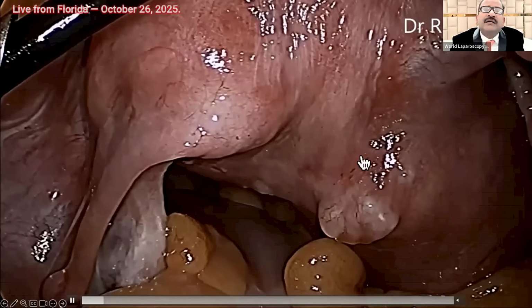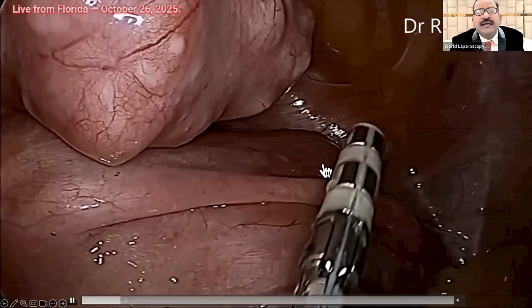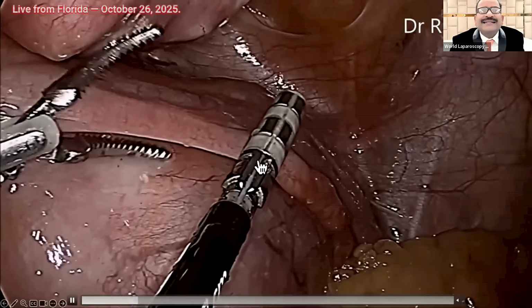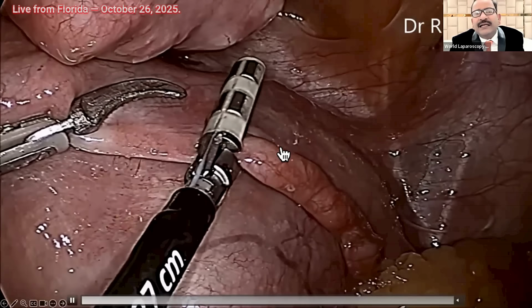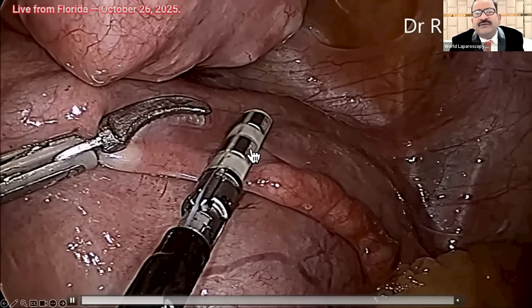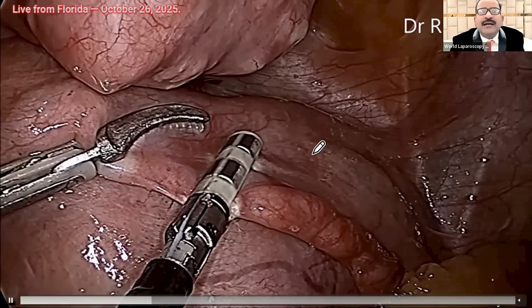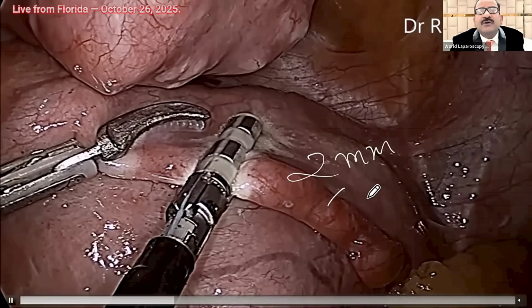We can see this is a hysterectomy surgery. This patient has multiple myoma, we can see, and here this is a fallopian tube. Round ligament is above, and on the right side this is LigaSure, on the left side this is a Robi dissector. And if you see here, it will only give you vapor, it will not give you black smoke, and the collateral damage on either side is only 2 mm. 2 mm collateral damage.